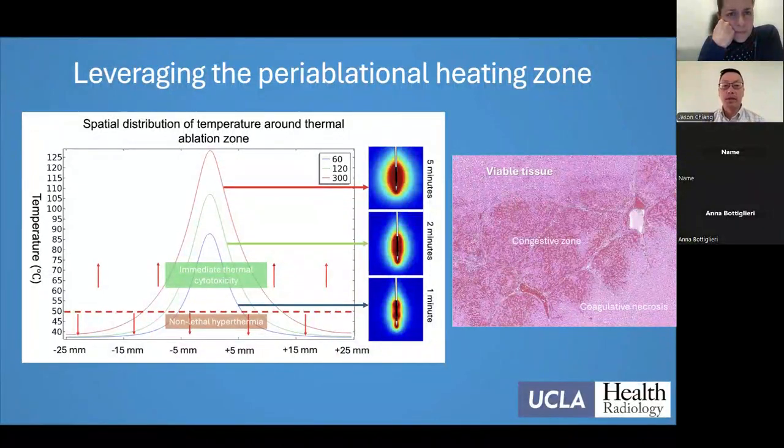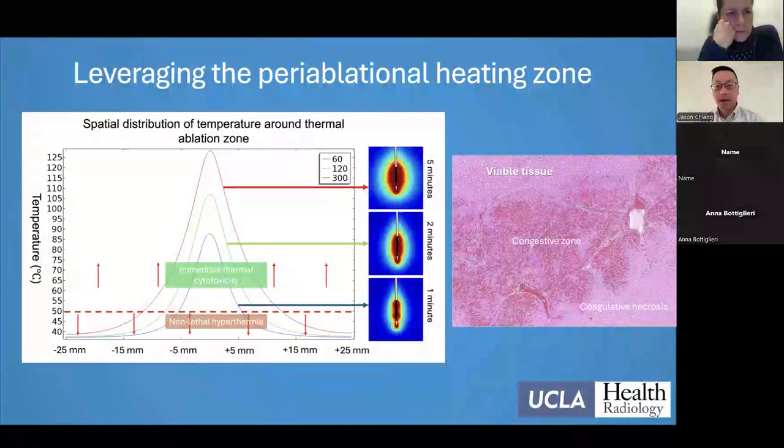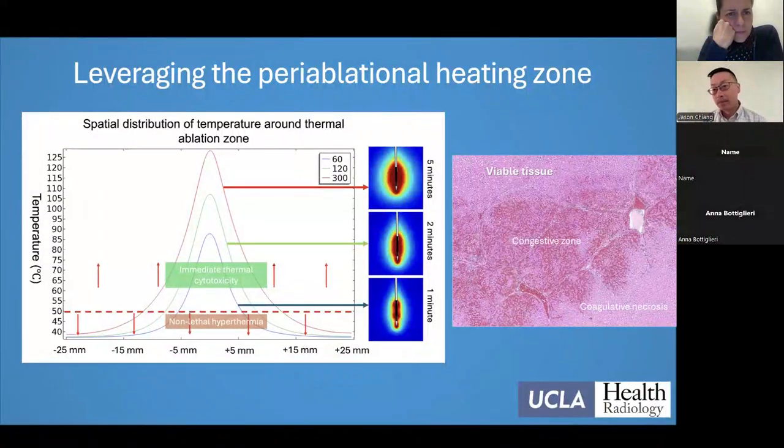I will say, for the advanced stage, it can be a little bit tricky. So not with microwave ablation, but in my practice, I get a lot of people asking me to do cryoablation with immunotherapy, for not HCC, but with sarcoma. And these patients, they have no other options. And they ask me, they say, hey, Dr. Chang, can you just ablate one of my tumors, and then while I'm on immunotherapy, you know, so they're kind of just trying.